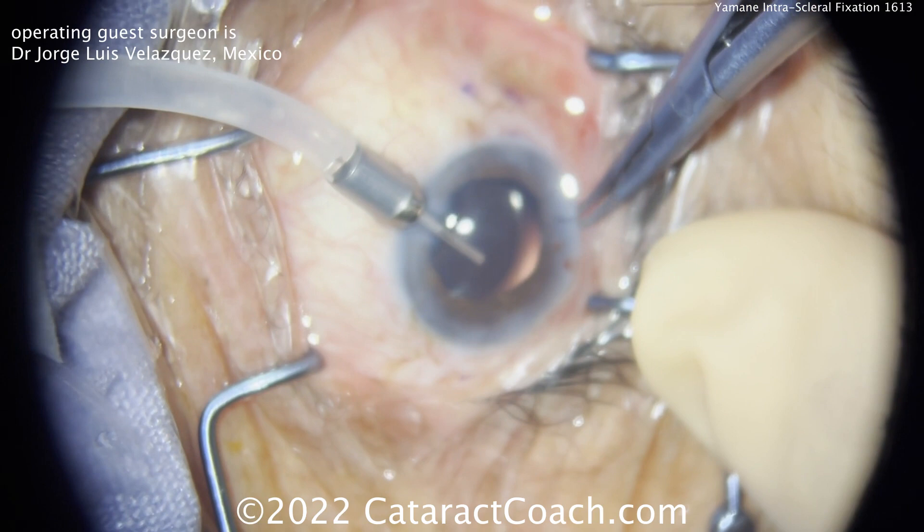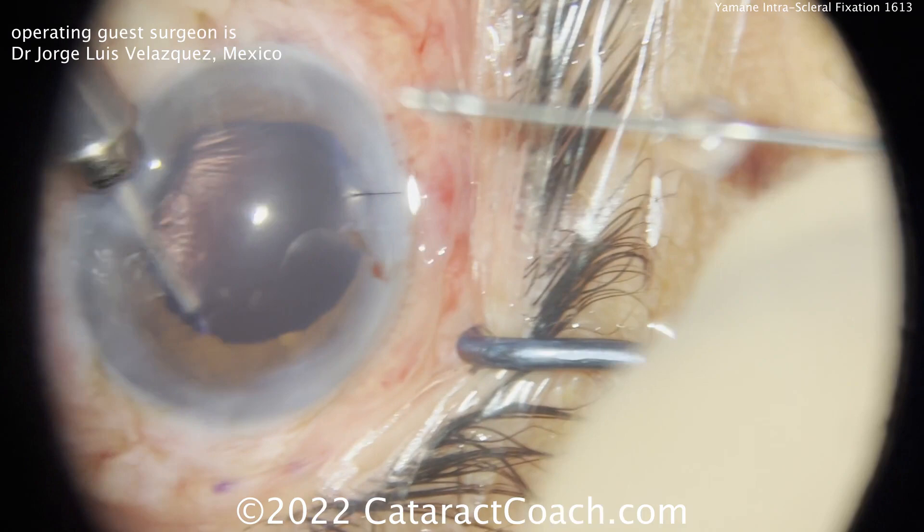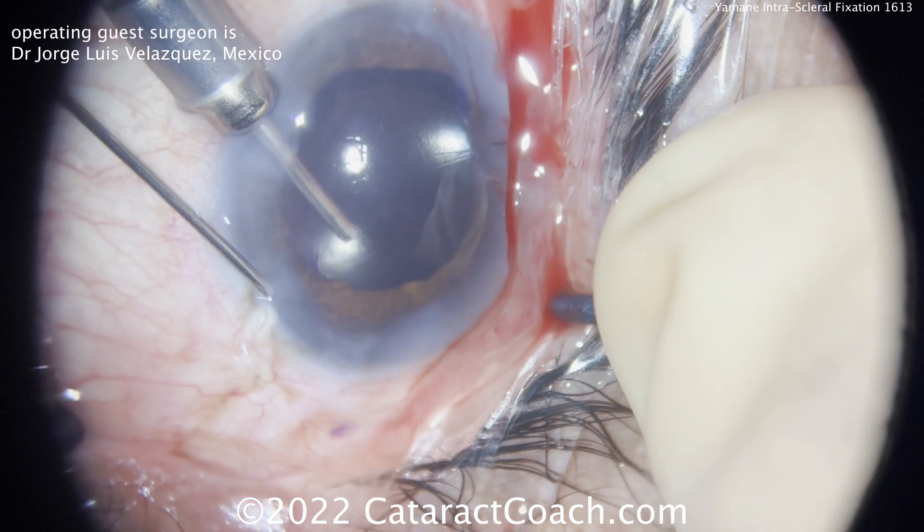It's tough sometimes to get those haptics completely evened out and the lens completely parallel to the iris, which is your goal. You can see here there's a little gap between the IOL optic and the iris. In a Yamane case, don't let the patient end up hyperopic — consider bumping up your IOL power, do the calculations as if it's an in-the-bag placement, and aim for at least a half diopter of myopia, maybe even a pinch more.